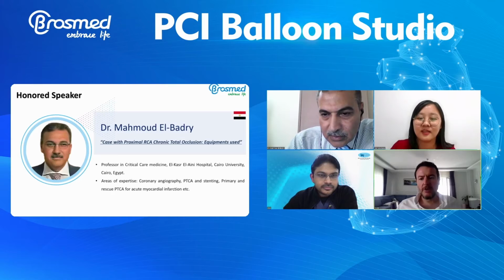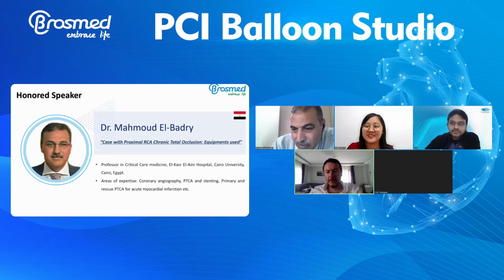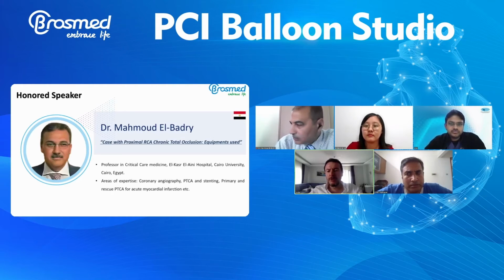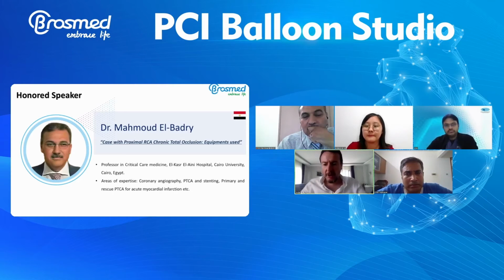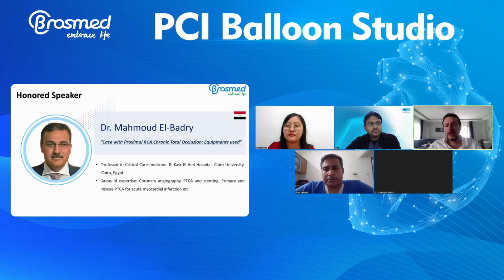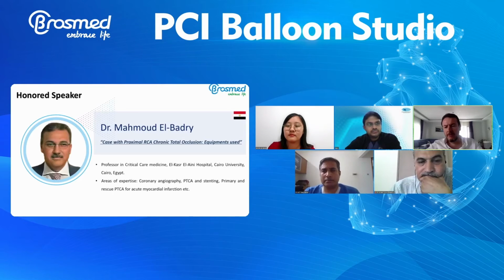I just want to say that BrosMed is on a good track. I have used a lot of balloons from a lot of companies, and we also have some reimbursement issues and cost problems in our country. The one affordable best balloon in Turkey is now the one from Apollo.